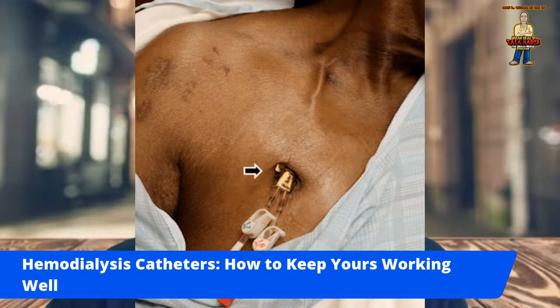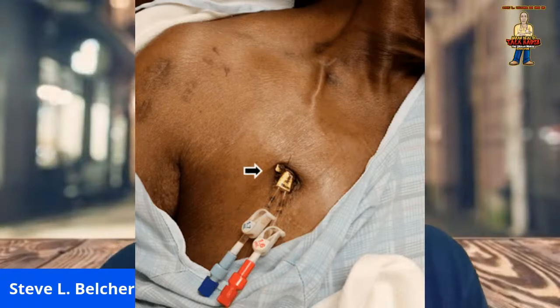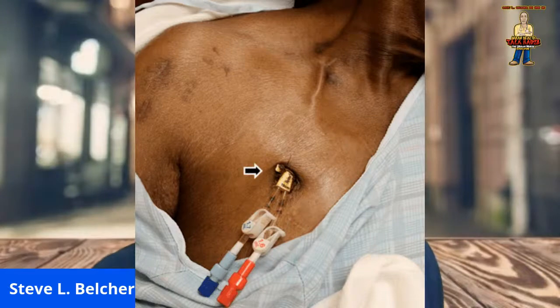The caps and clamps. Let me show you. The caps right here. You see those two white pieces? I'm sorry, the two white pieces are the clamps, and then the caps are at the bottom. Your catheter should be kept tightly closed when not being used for dialysis. Only the care team should use your dialysis catheter to draw blood or to give medications or fluid.